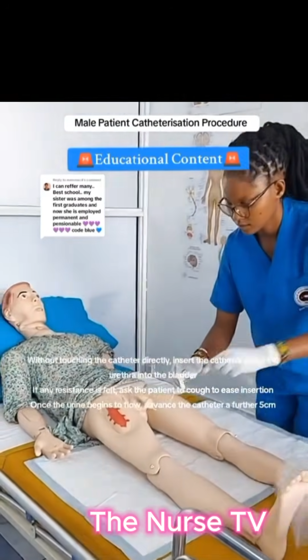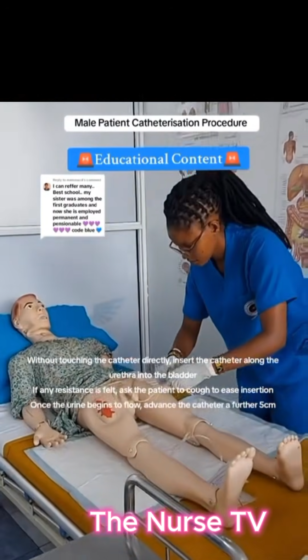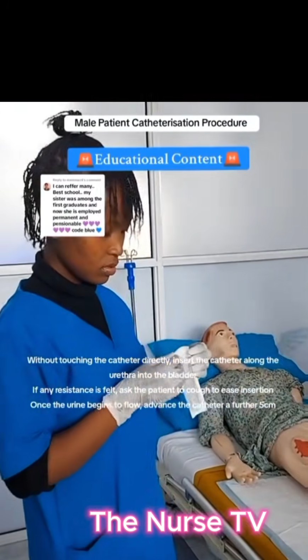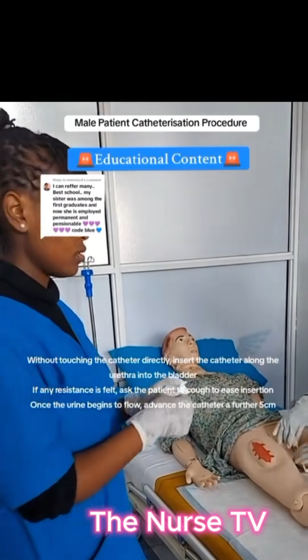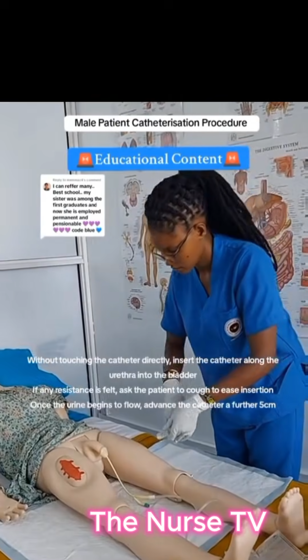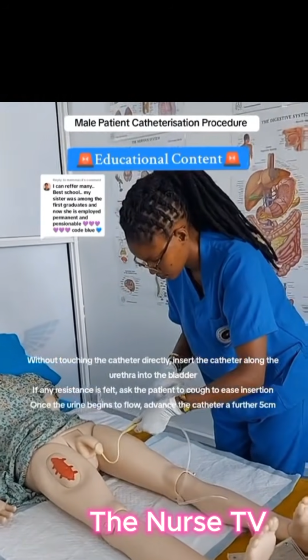Without touching the catheter directly, insert the catheter along the urethra into the bladder. If any resistance is felt, ask the patient to cough to ease insertion. Once the urine begins to flow, advance the catheter a further 5 centimeters.